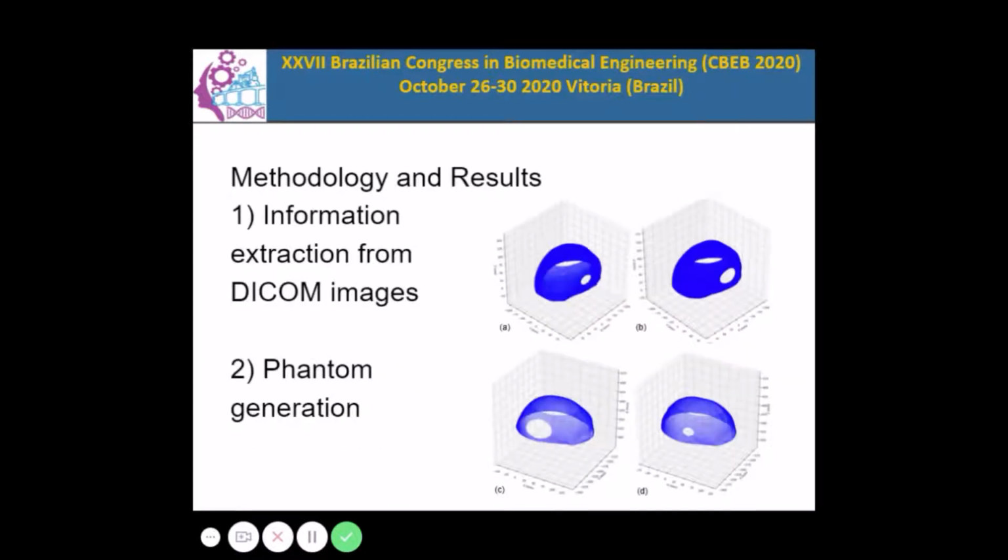The first step of the methodology is the use of a fixed threshold value of 200 Hounsfield units to determine the interface points between bone and adjacent tissues. Each bone contour is defined as a list of points with X and Y coordinates in pixels for each image. Those are the gold standard contour points and represent the external bone surface of the skull.